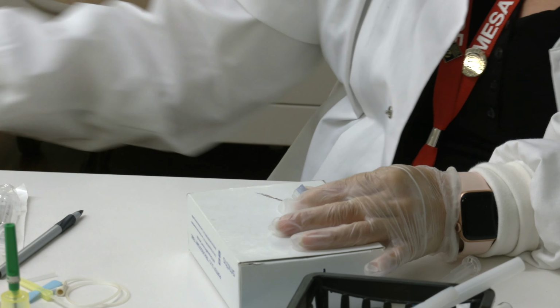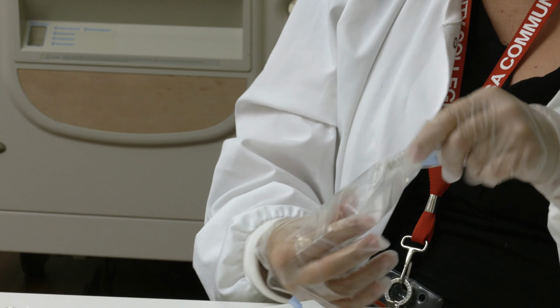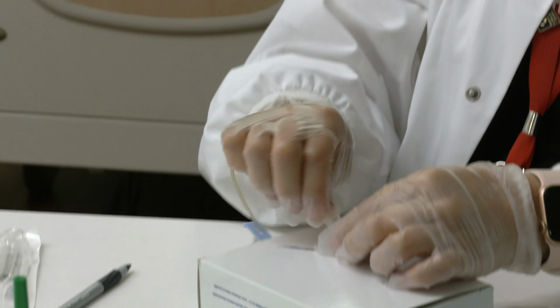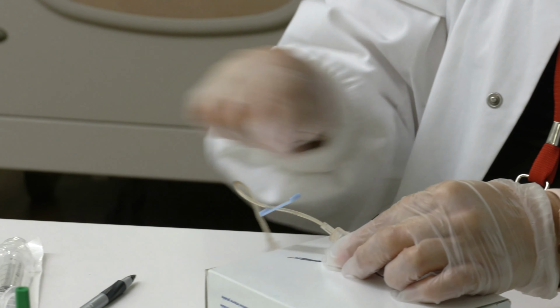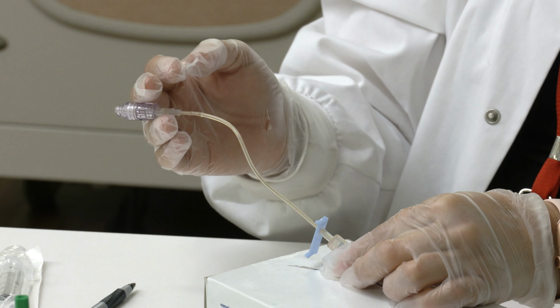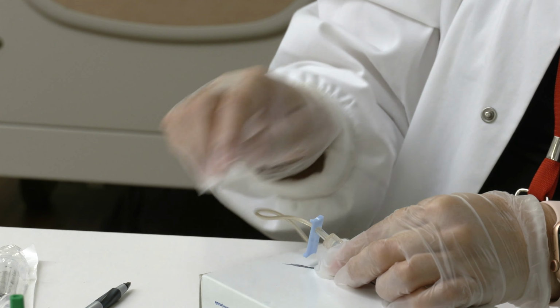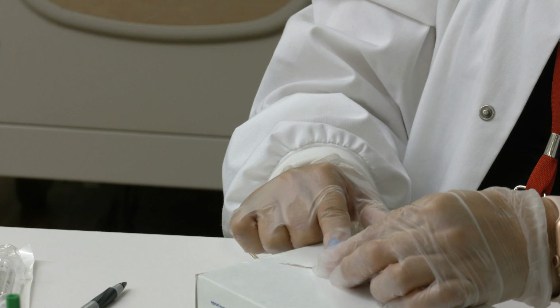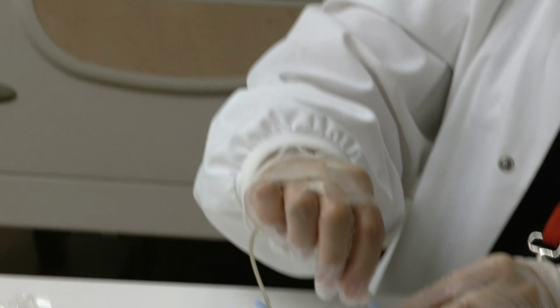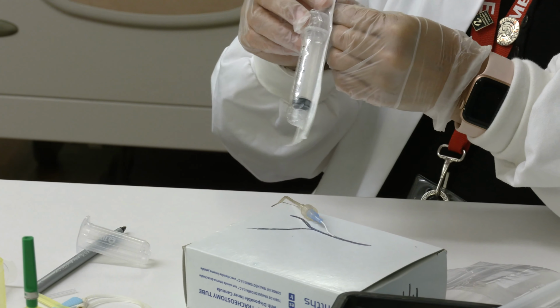What you can't do for any IV is you can't fill your extension set up with normal saline, hook it in, and then draw blood, because then your saline will be all the way through this tubing and it'll mess up your lab results. You'll dilute the blood that you've drawn out and it'll end up with a different number than what is actually what your patient has. So usually the safest is to either go straight to the catheter or to not put any saline in here, put it on dry, and then draw straight from that piece.